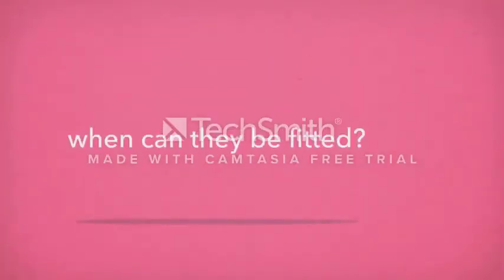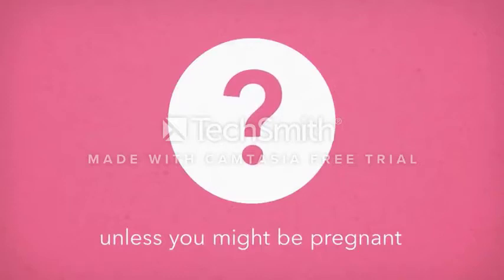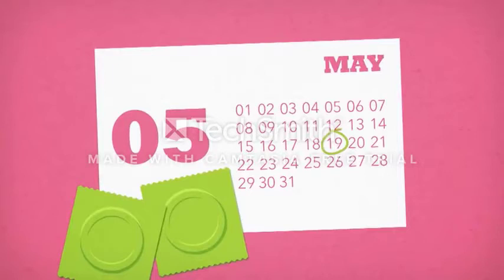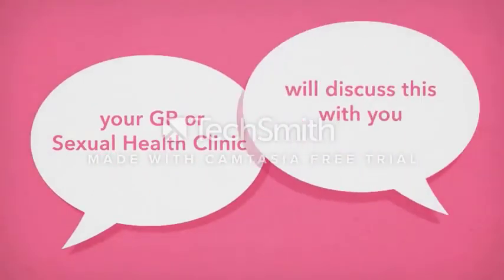When can they be fitted? The IUD and Mirena can usually be fitted at any point in your cycle, unless you could be pregnant. We therefore ask that you do not have unprotected sex after your last period until your appointment. Some women need extra tests before having an IUD or Mirena fitted. For example, women with very heavy or unpredictable bleeding. Your GP or sexual health clinic will discuss this with you and organise extra tests if they are needed.